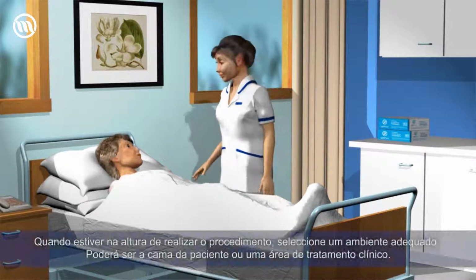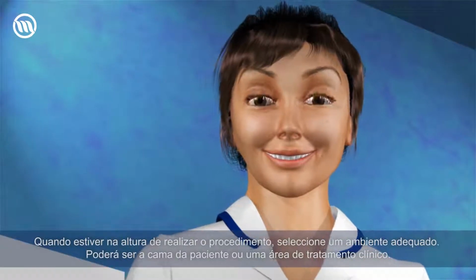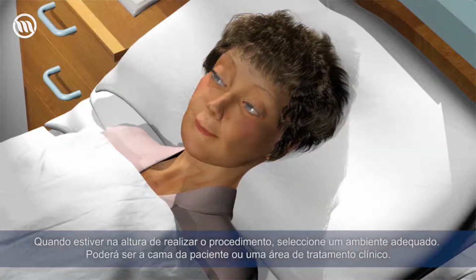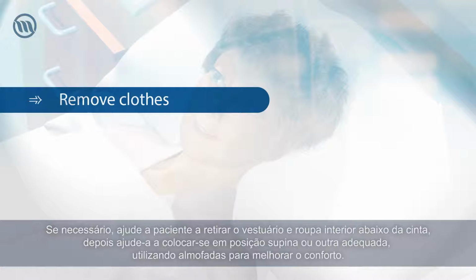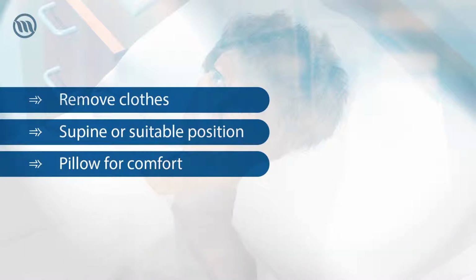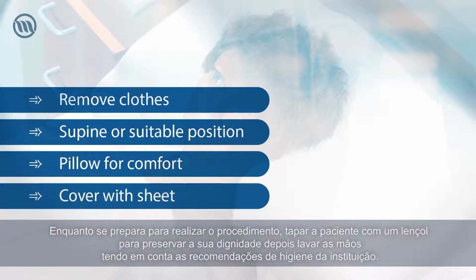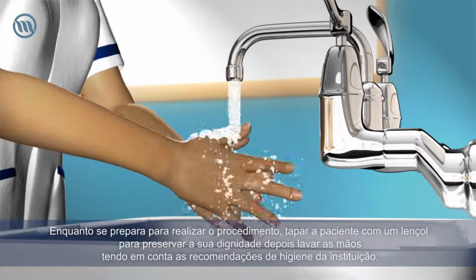When it's time to carry out the procedure, identify a suitable environment. This may be the patient's bed or in a clinical treatment area. If required, help the patient remove their clothes and undergarments from the waist down. Then help them to get into a supine or other suitable position, supported with pillows for comfort. Cover the patient with a sheet to maintain their dignity until you are ready to undertake the procedure. Then wash your hands in line with your trust hygiene policy.